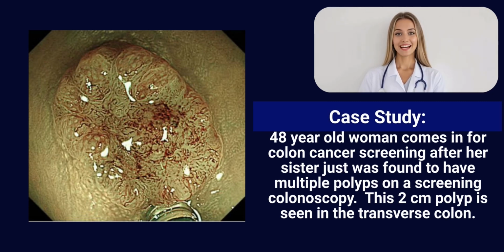Can you describe the color demarcation, microvessels, and microvessel pattern? This is an NBI image, and the vessels are very thick and dark, especially in the middle. Yes, this is an NBI image and the vessels are abnormal. Can you assign it a NICE classification and tell me what you think the diagnosis is? I am not sure about the NICE classification, but I think it is an adenoma. Actually, this is a malignant NICE 3 polyp.